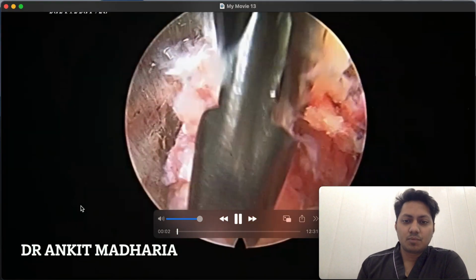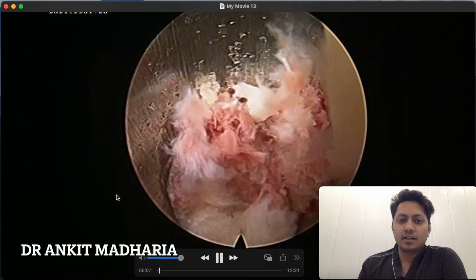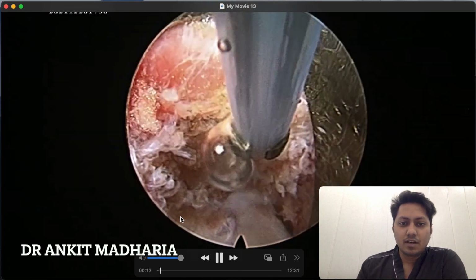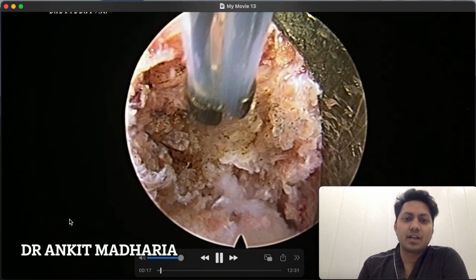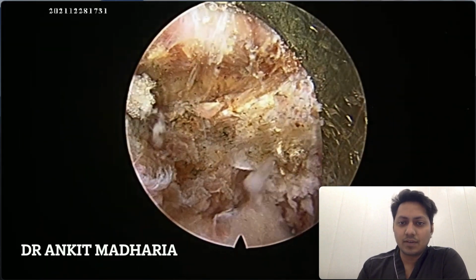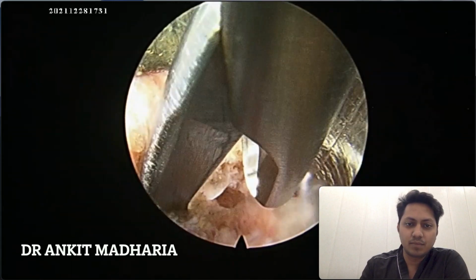So this is the endoscopic picture after I enter the disc. The main thing that I see is the disc material lying subannular. As soon as I have removed the disc material, I withdraw my cannula to see the edge of the annulus. Now, in case of stenosis surgery, I always want to cut the annulus because it is a bulging disc and I want to remove it completely.